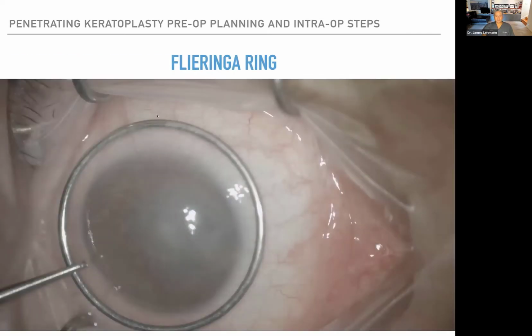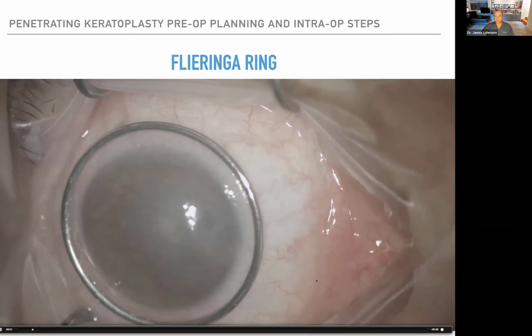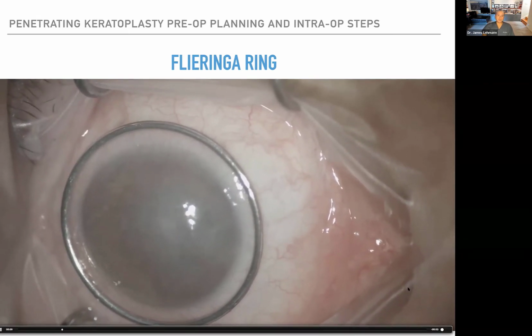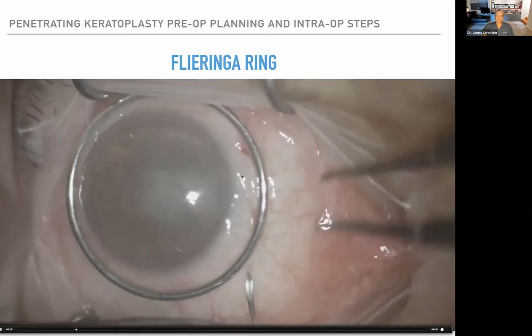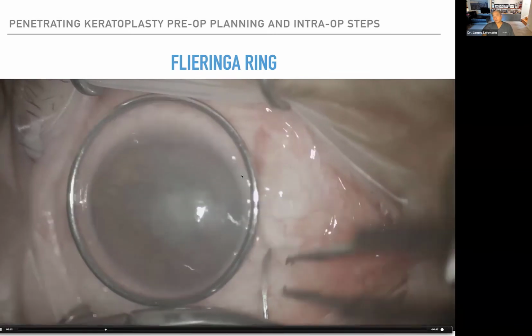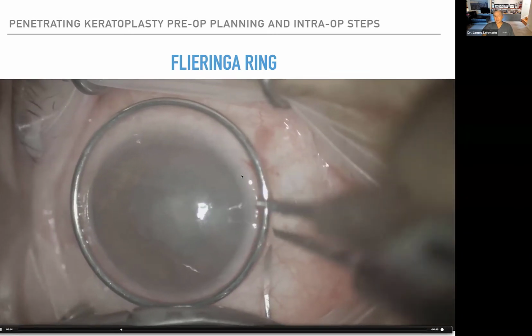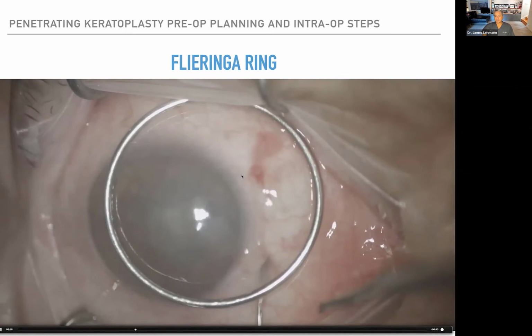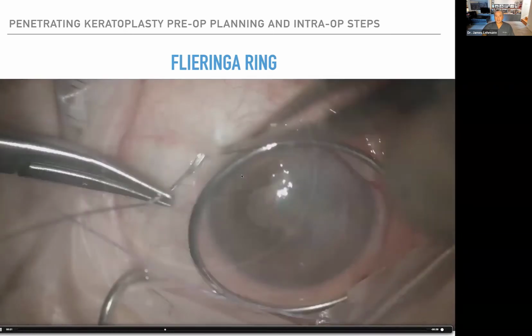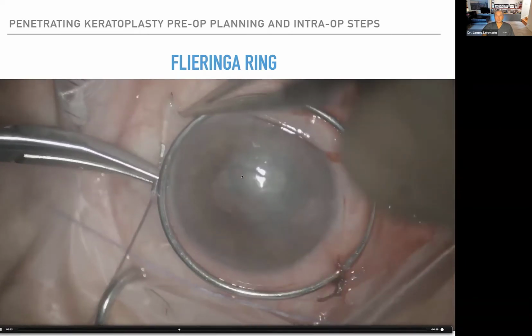So here's a little video showing placement of the Flieringa ring, okay? Basically you want a size that's about 2 millimeters outside the limbus. You can see that area there. And then you want to use a spatulated needle. It can be silk or it could be Vicryl. They don't have to be radial passes. They could be oblique. You just want to get a little bite of the episclera, and then of course in and out of the conjunctiva. And then you're going to tie a 2-1-1 knot.